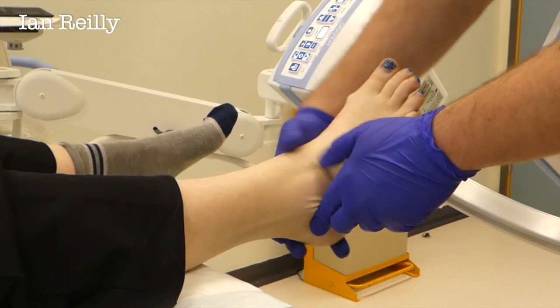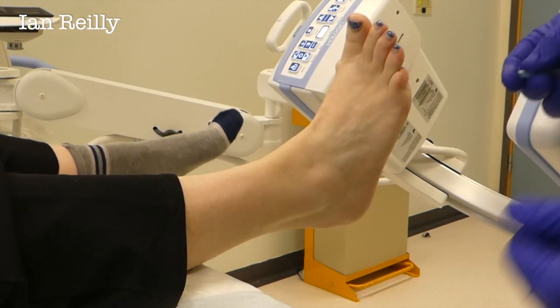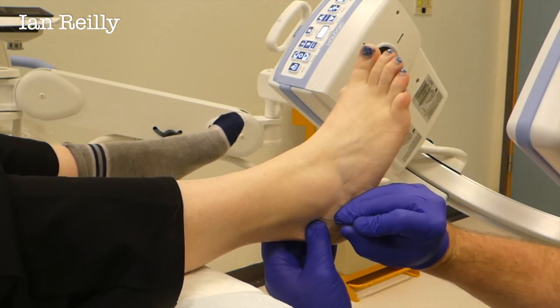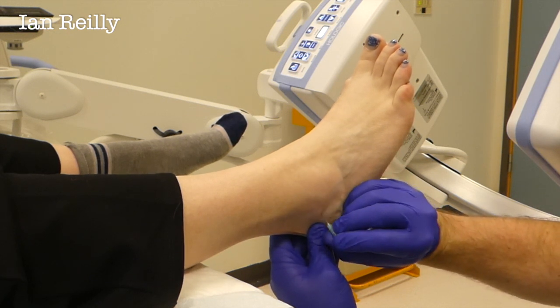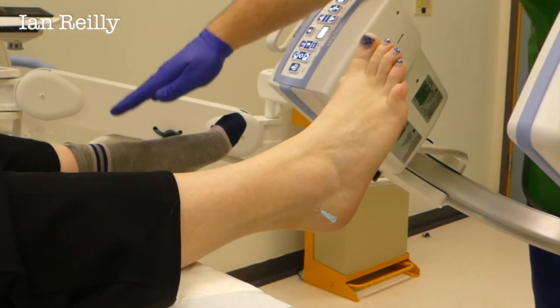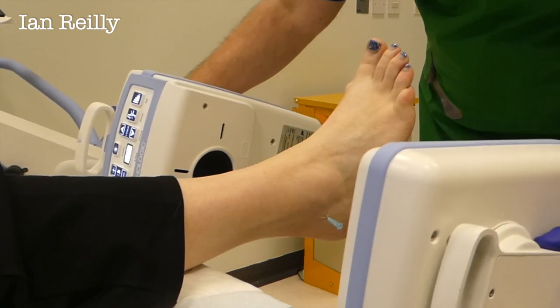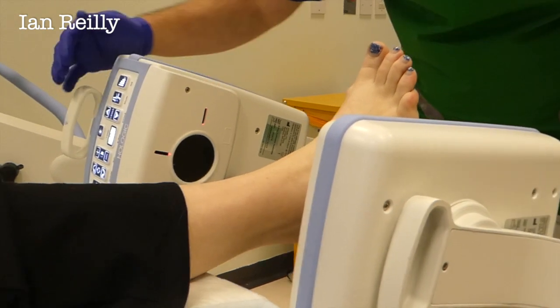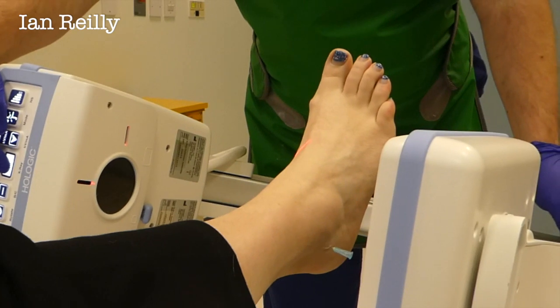I wish you could see this patient's face, which is beautiful, but she's grimacing. All right, let's get started. We'll do a sharp scratch now. Could you bend that knee? Now we can't see a blessed thing, so I'm just going to come in for the camera a little bit. Let's see where we are first.